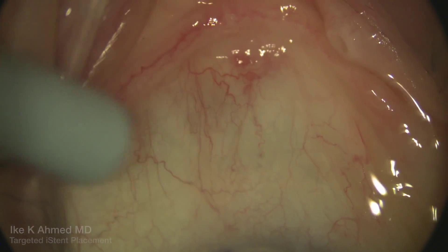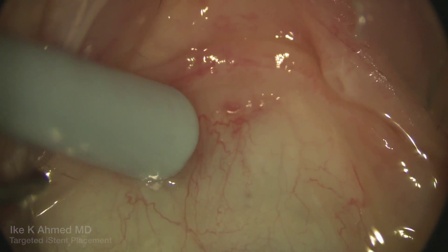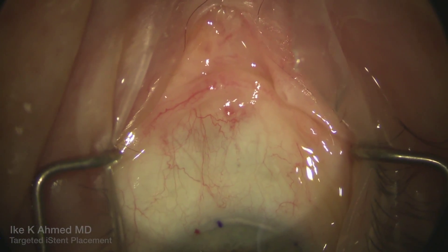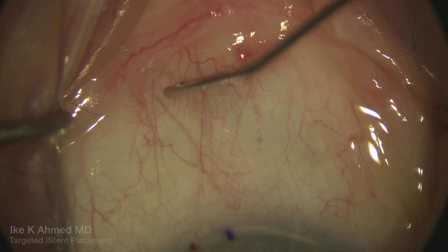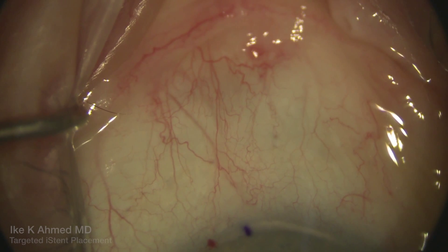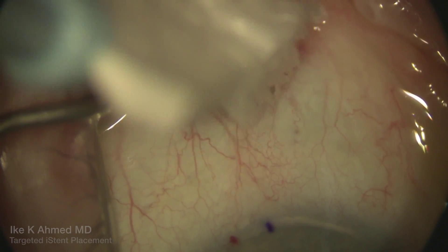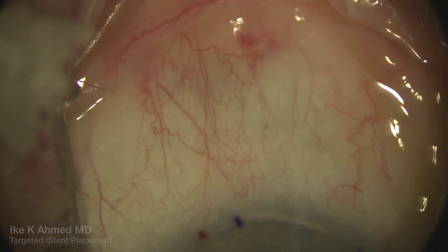Theoretically, by placing these devices in the proximity of the aqueous vein orifice, we feel that we can directly pass aqueous through the distal outflow system and therefore theoretically reach a lower pressure by eliminating some of the resistance to that aqueous reaching those veins. As you watch, you can see the blood fill up the vein as the pressure is dropped in the anterior chamber, followed by irrigation to increase the pressure in the eye, showing the blanching of the vein.